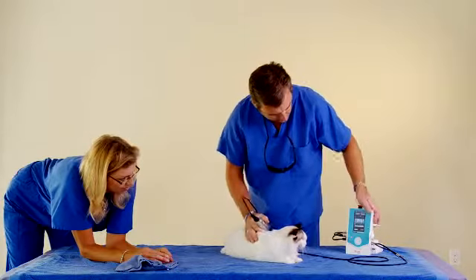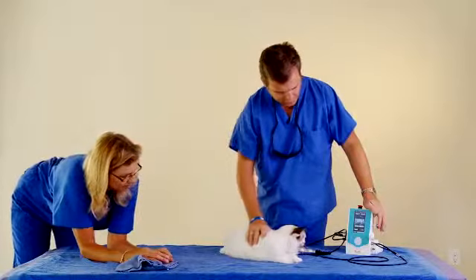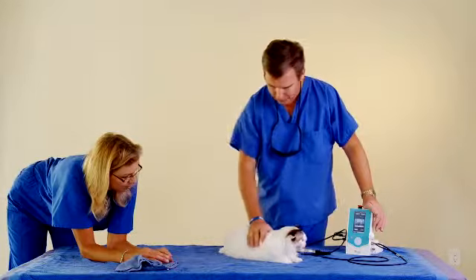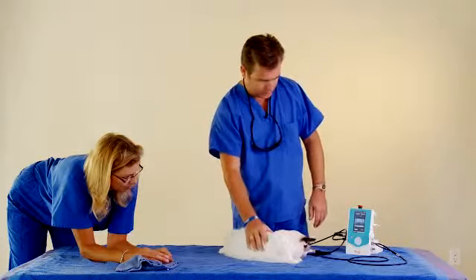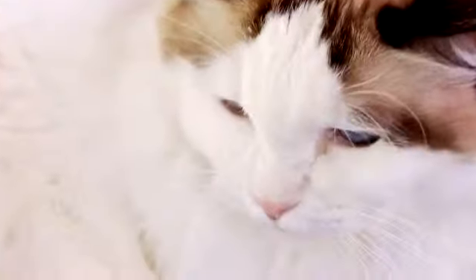So we turned it down a little bit. And when you're in question, just treat under. You can always go back and treat again if you feel like you didn't get the correct amount of joules in the animal. You can always go back and go through a second round of treatment until you get a little bit more comfortable treating that size of cat.